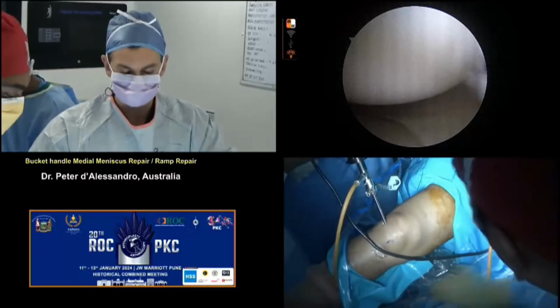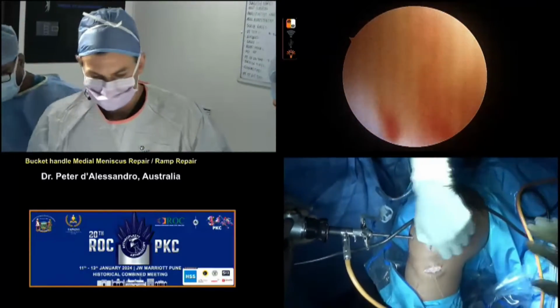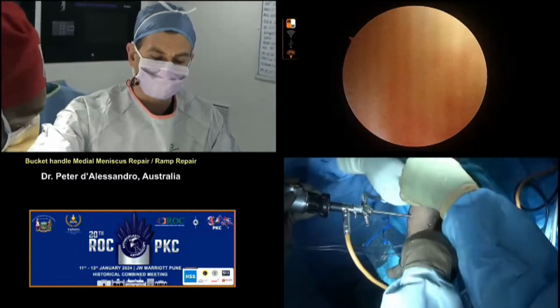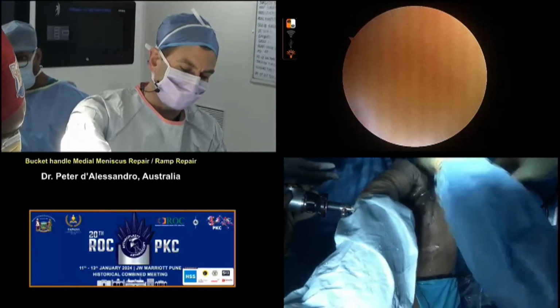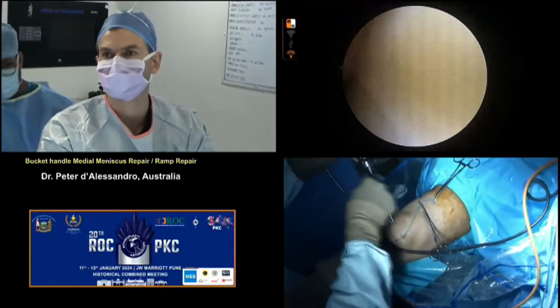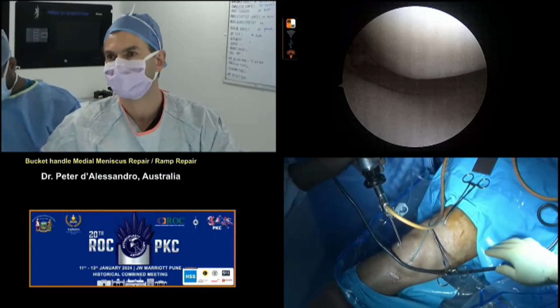Peter, if you're going to do a root repair, say you had a lateral meniscus posterior root tear and you're going to repair that, would you still make your tibial tunnel, ACL tunnel, or? So if I'm doing a root, I'll do my ACL tunnel, then I will do my root tunnel, and I always like, for a lateral root, a separate tunnel. The only time I bring my lateral root into my ACL tunnel is in a multi-lig where I'm worried about the amount of tunnels in the knee, and then I'll do my root tunnel, then I'll pass my root sutures, then I'll pass my graft.